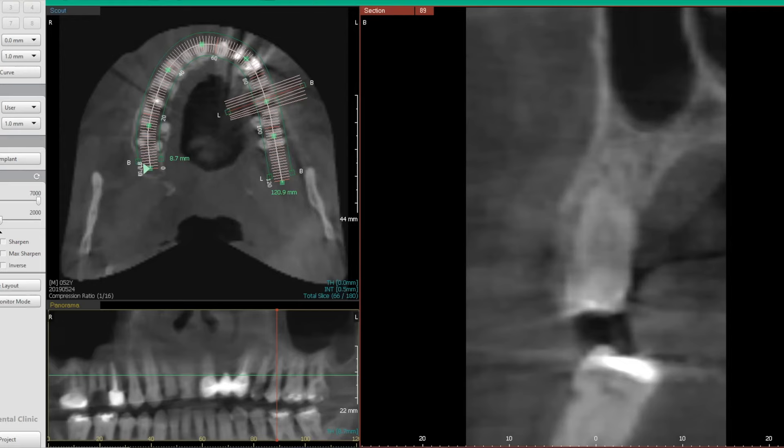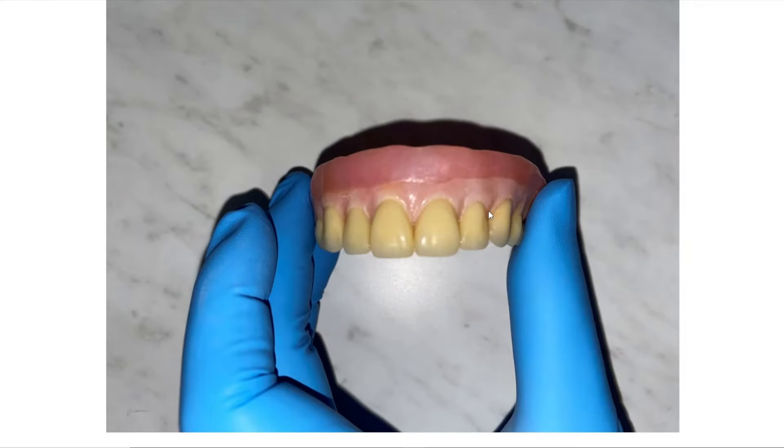I wanted to show you — here's a denture a patient came into our office with that their dentist had made. This was an elderly gentleman, and when I look at a case like this it's very important that your dentist talks to you about tooth shades, colors, and the finish of the denture. This is just a poorly made, poor-quality denture, and if you're going to be wearing something like this, we want to make sure it looks good. There is a real difference among dentists in the quality of denture they produce.